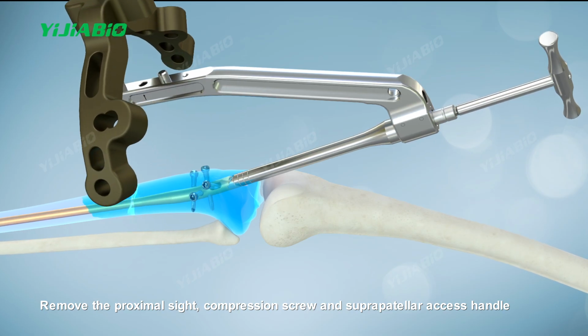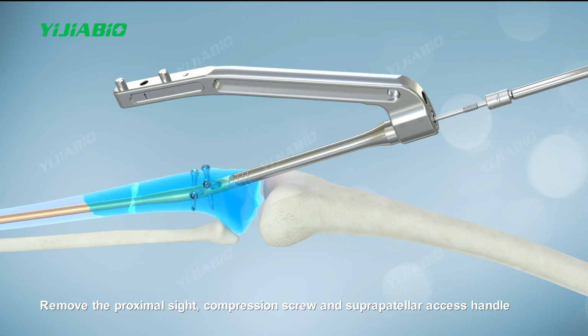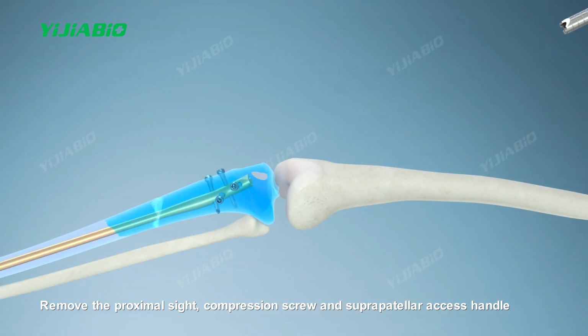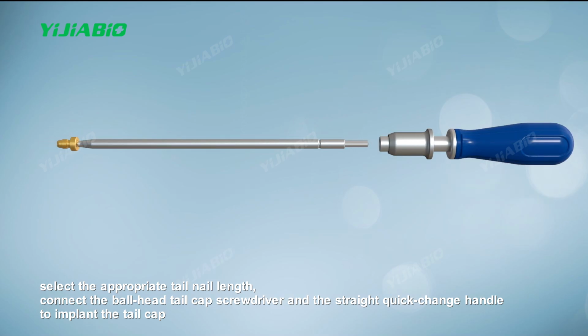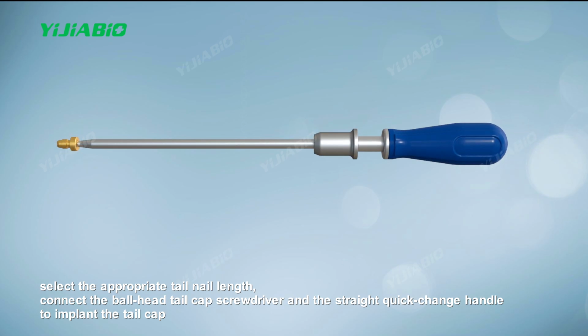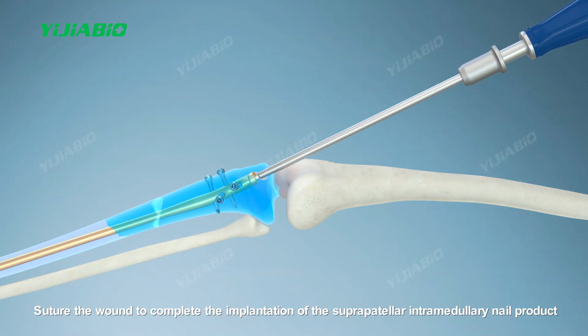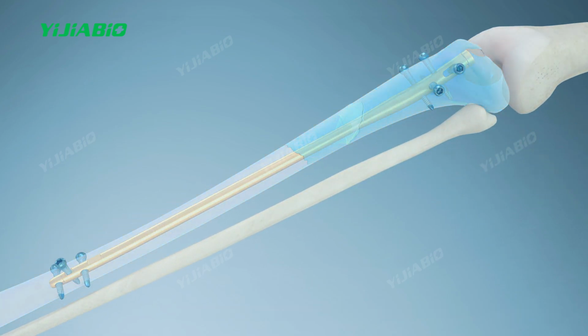Remove the proximal sight, compression screw, and suprapatellar access handle. Select the appropriate tail nail length. Connect the ball head tail cap screwdriver and the straight quick change handle to implant the tail cap. Suture the wound to complete the implantation of the suprapatellar intramedullary nail product.